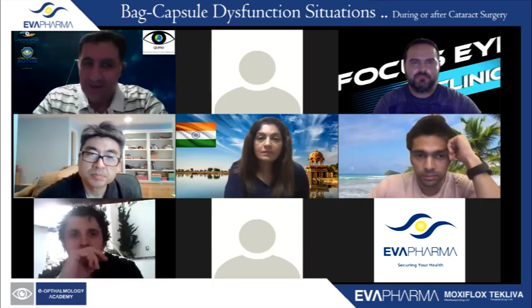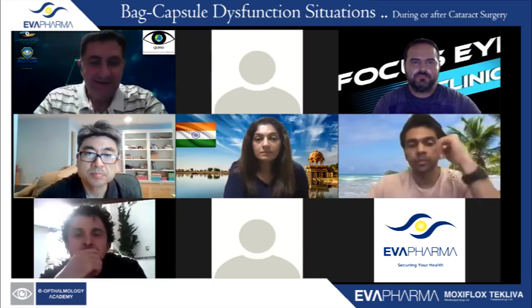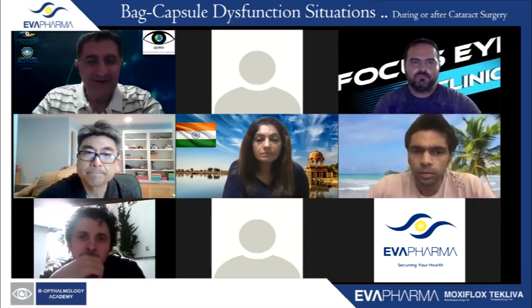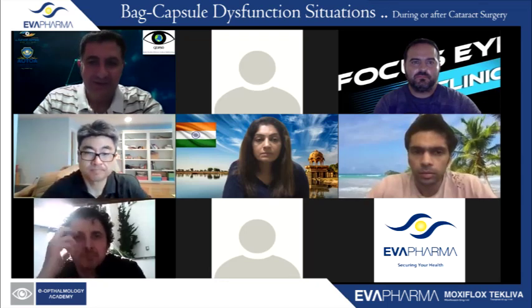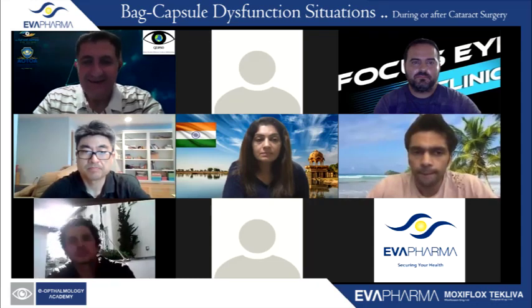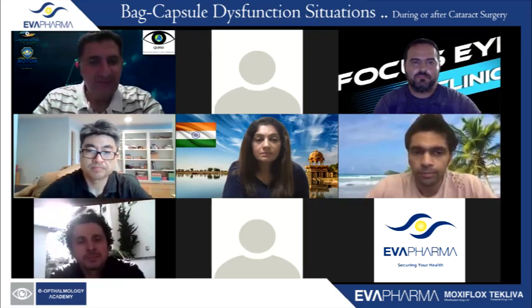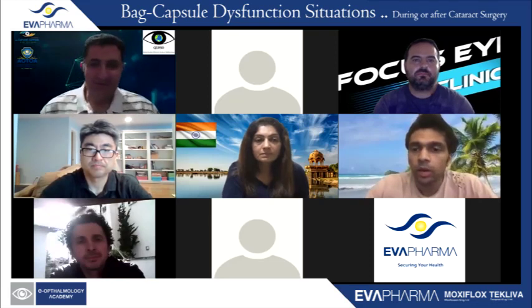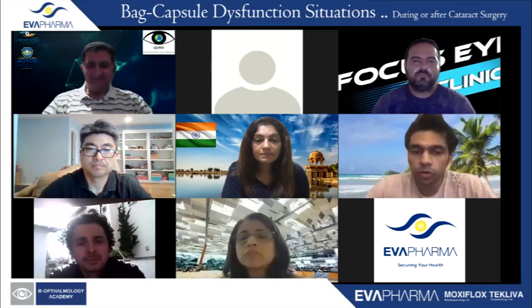This is extremely professional. And the other one, how you were so patient that you remove all the bag and the cortex of the IOL and keeping the IOL in the first case clear till you bring it in front and you fix it. Extremely perfect.